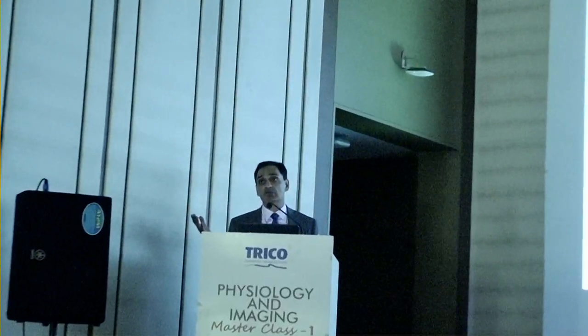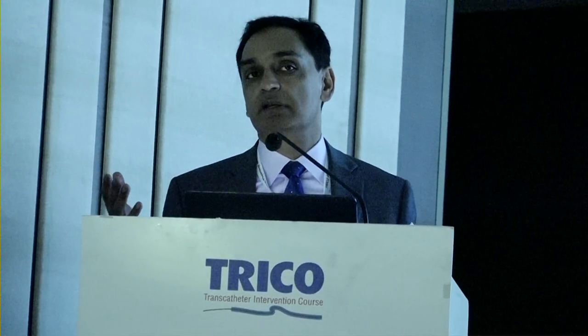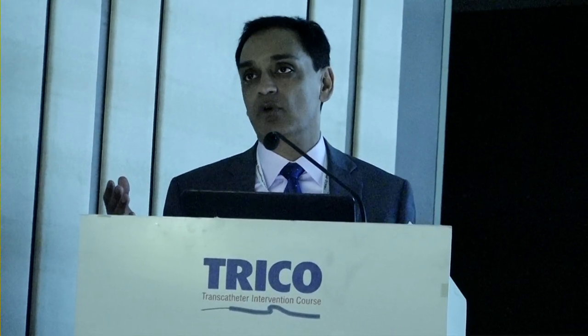But again, aspiration has gone out of favor with all the guidelines and clinical evidence. So I think I don't have a specific way. I think it's more about recognizing what you're seeing when you do the imaging. But certainly high pressure inflations I would avoid, because that really disrupts what you're going to see, and you're never going to detect the erosions and the sort of plaque rupture.